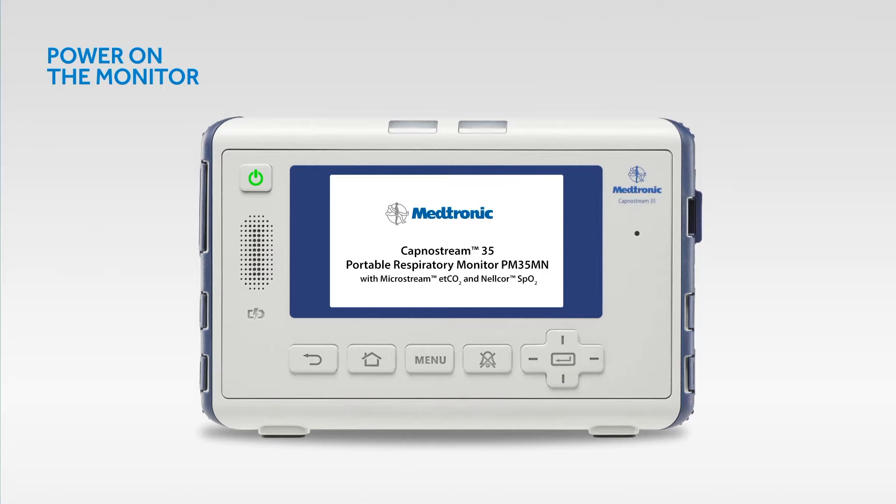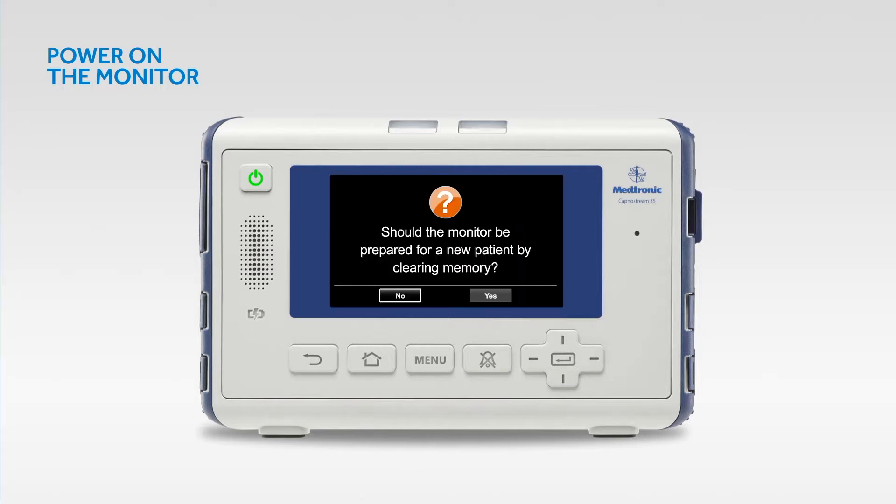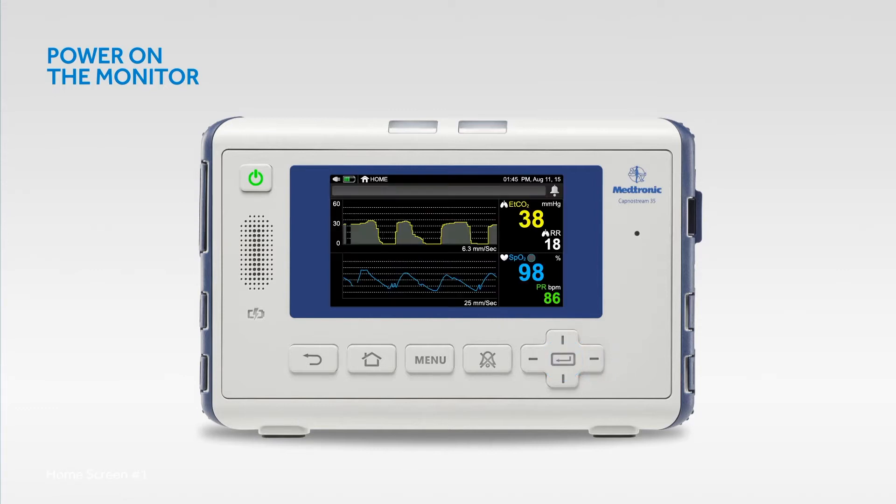If the monitor is set to disable EMS mode, every time you turn on the monitor you will see a prompt to clear trend memory. Press the enter button to continue monitoring the same patient. If you are monitoring a new patient and want to clear any information regarding the previous patient to avoid mix-ups, select yes and press enter. Having EMS mode enabled will take you directly to the home screen. Please note that while in EMS mode, existing data will automatically be cleared when you turn the monitor on and admit a new patient.